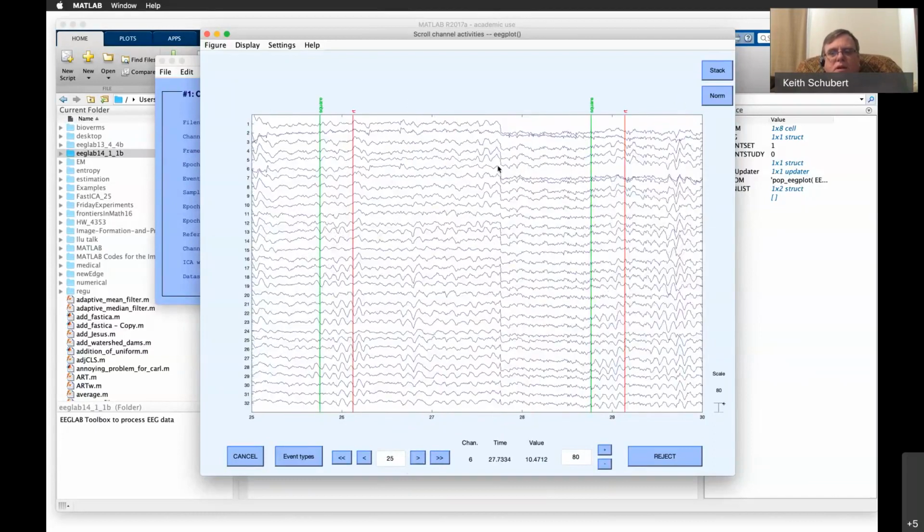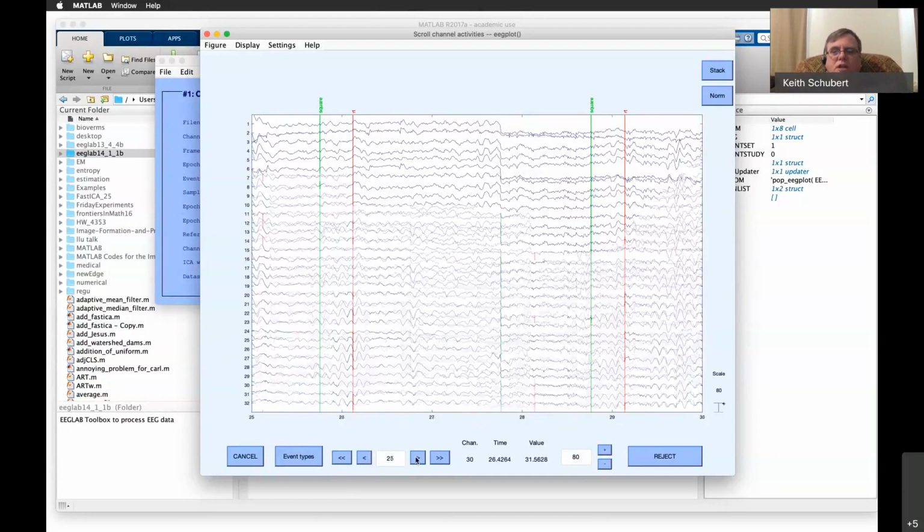You can see another big discontinuity. These happen. Sometimes the person wiggles and the electrodes don't connect right. Or the person sneezes or something, and you might get a very clean discontinuity. With a sneeze, you tend to get a lot of muscle activity. But somebody might have come in and also cut that data out, and so now they're spliced together. Another reason those sometimes happen.